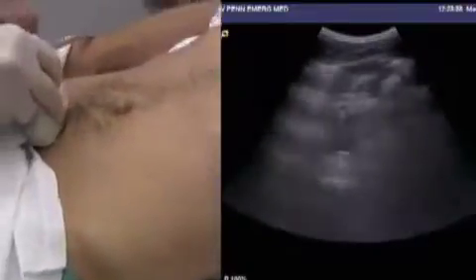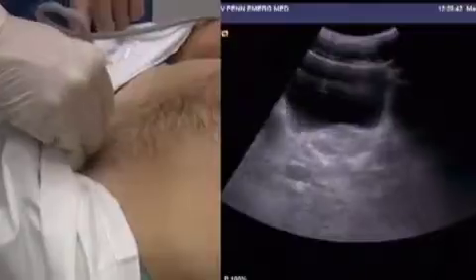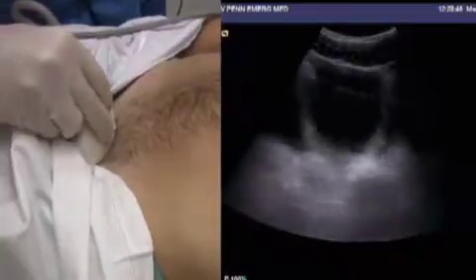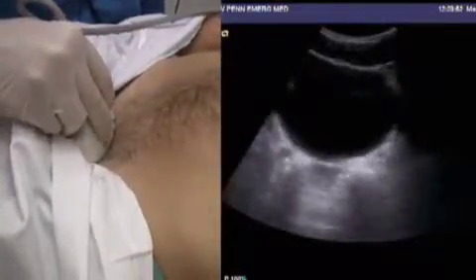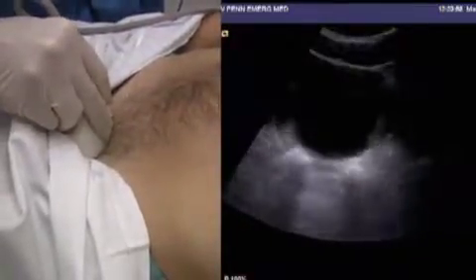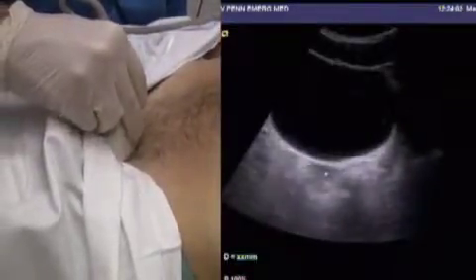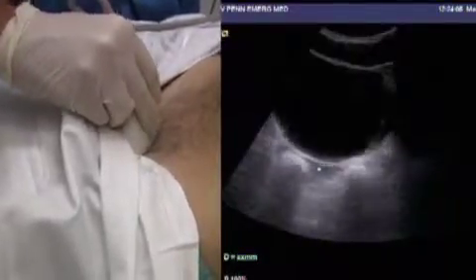And then finally in the suprapubic region. Starting with prostate, seminal vesicles. Right here we need to decrease our gain a little bit. And actually it looks like there might be a small physiological amount of free fluid right here in the pelvis on this model. It looks kind of pointy. We can see it right here — it's sort of between these loops of bowel. There's probably a small physiological amount of free fluid.